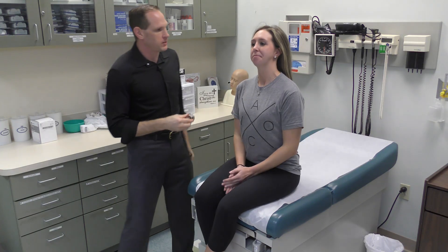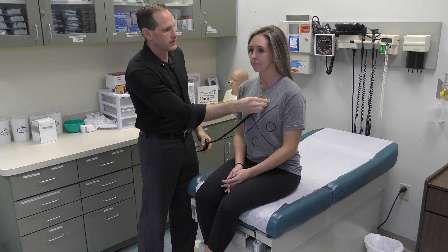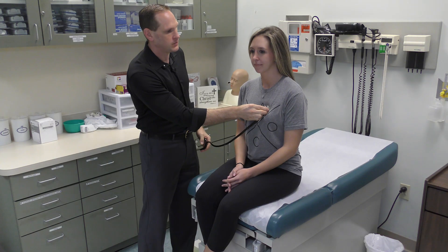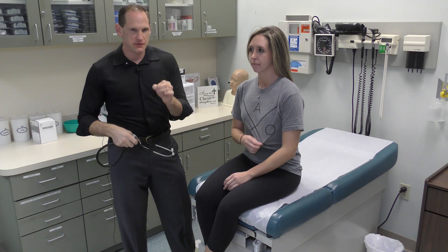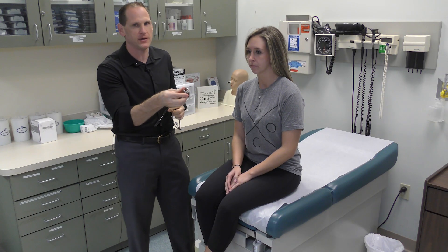When it comes to assessing the patient, we're going to go straight to the heart. When we listen to the heart, we're going to place the stethoscope at the second intercostal space, right sternal border, then second intercostal space left sternal border, then down one, down one, and then over and up. That fifth intercostal space midclavicular line is actually underneath the breast tissue, so you have to lift up into the breast.